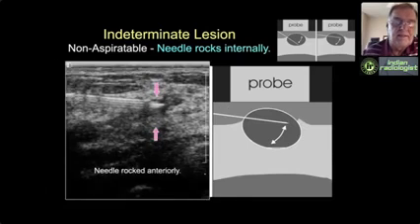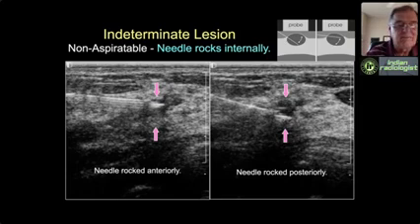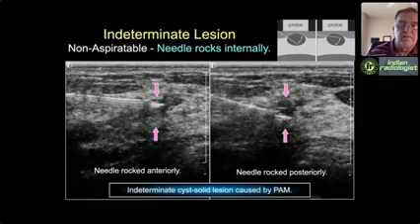Now, in this case, I couldn't aspirate the cyst. I've rotated the tip of the needle anteriorly to the front wall of the cyst, shown by the anterior pink arrow. But now I've been able to move the tip all the way to the back. So even though I can't aspirate this, because apocrine metaplasia, remember, is just 2 cells wide, it's not solid. It's just little gracile papillary excrescences that can easily be torn by the needle as I rock it front to back. So this shows that this is just apocrine metaplasia.